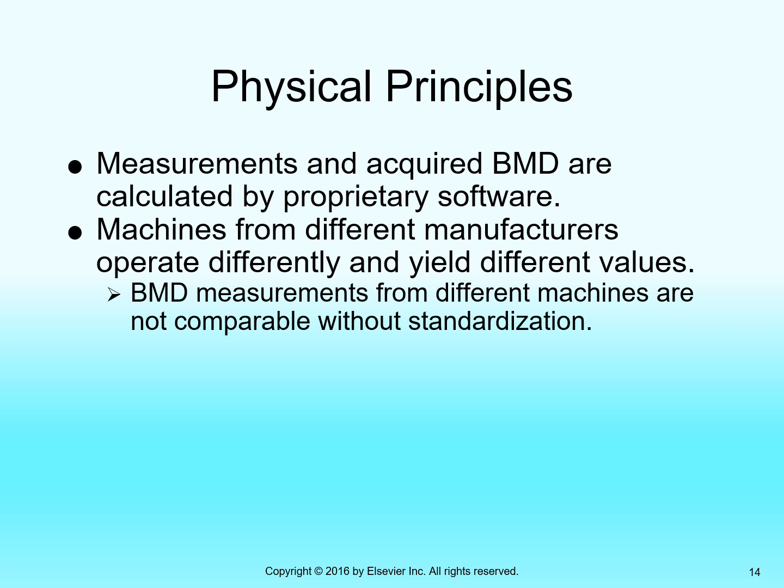We understand photoelectric effect is being manipulated. At low kVp, photoelectric effect is more probable. It's most probable always with higher atomic number target atoms. And so we're going to see a difference across all tissues between low energy attenuation and high energy attenuation. But tissues that have calcium are going to have an even greater difference than all other tissue types.